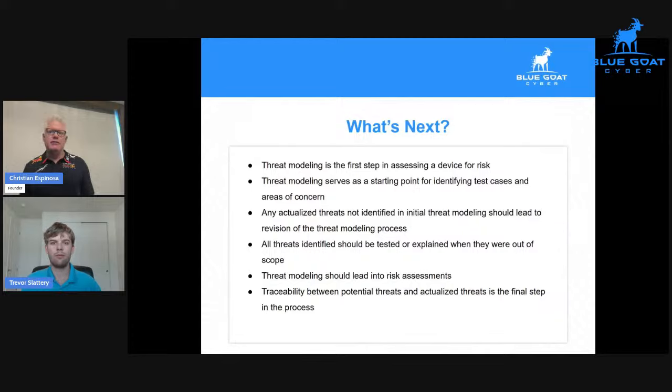So this is a lot of education and awareness. And unfortunately, like I think we mentioned on a podcast or something, most software developers don't understand cybersecurity. And like you kind of talked about it, their purpose is to build something that works. Our purpose for these test cases, as you mentioned, is to try to get some unexpected or weird behavior out of the device that it wasn't designed for in order to realize something nefarious. And that's the lens we look at versus the software developers just trying to add the functionality and get, like you said, the minimum viable product complete as well.